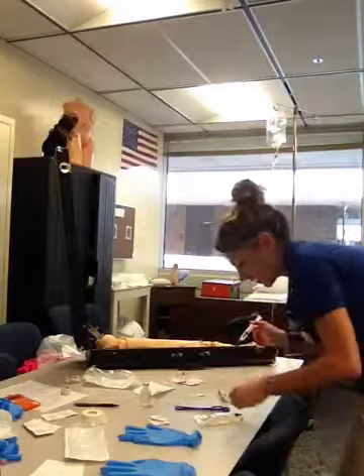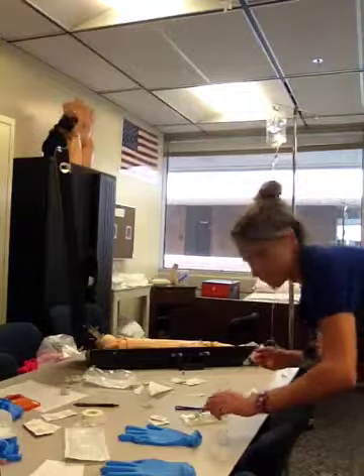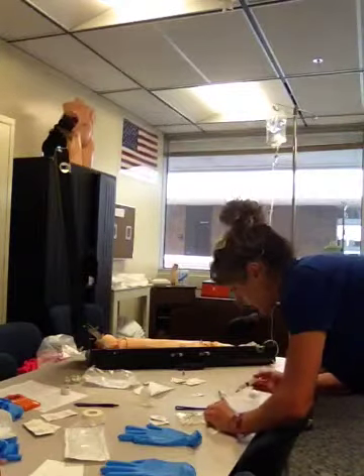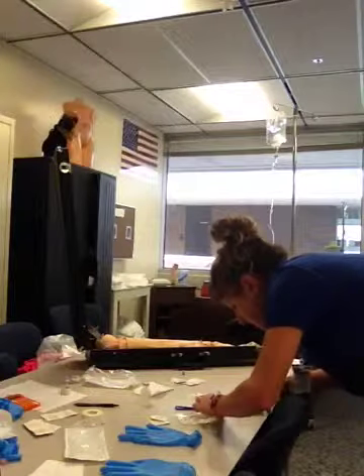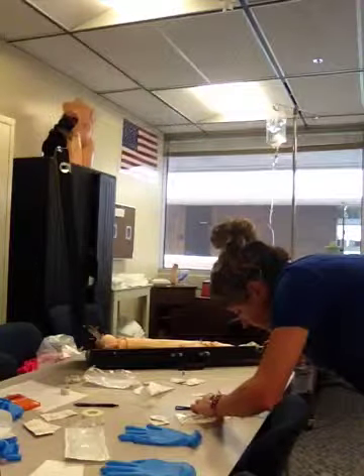I'm going to clean the port on the mini bag. Then insert the medication.